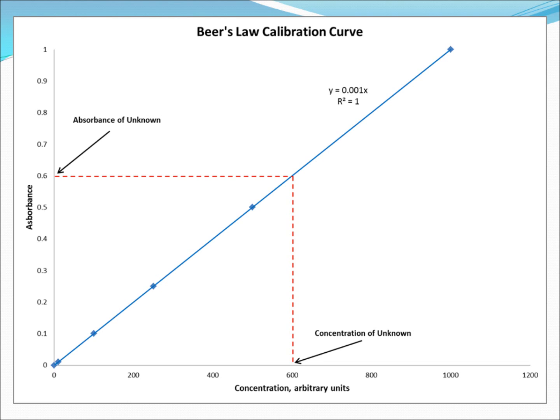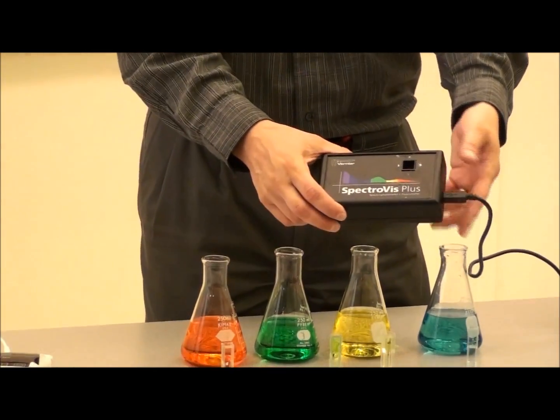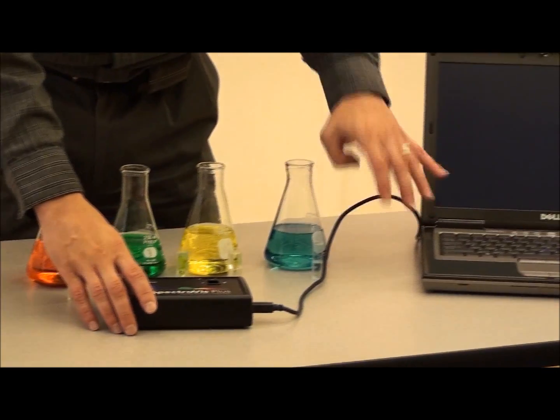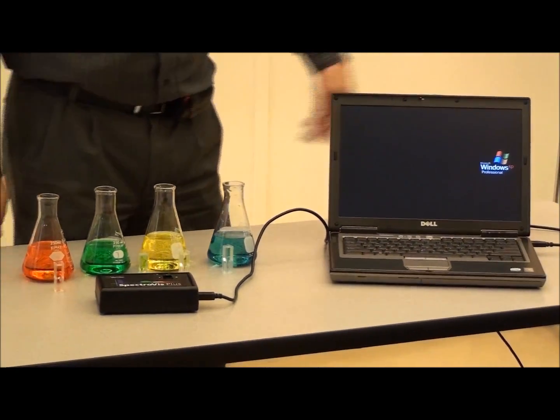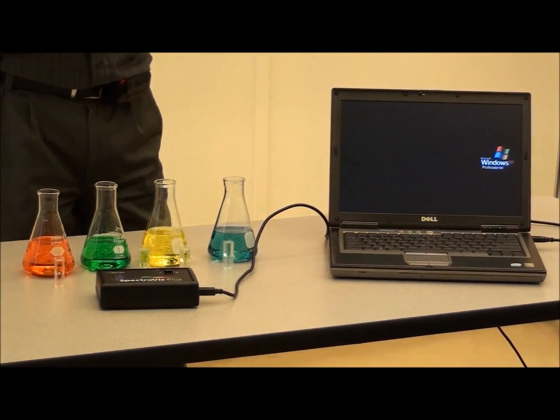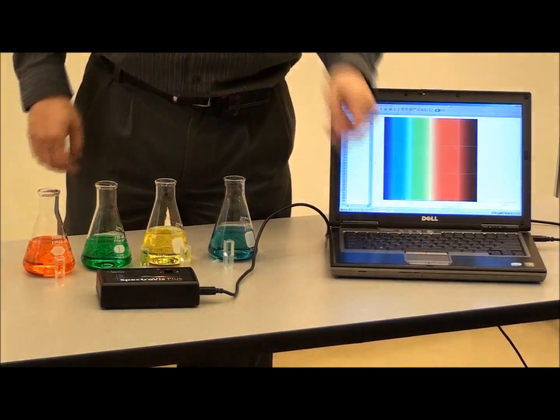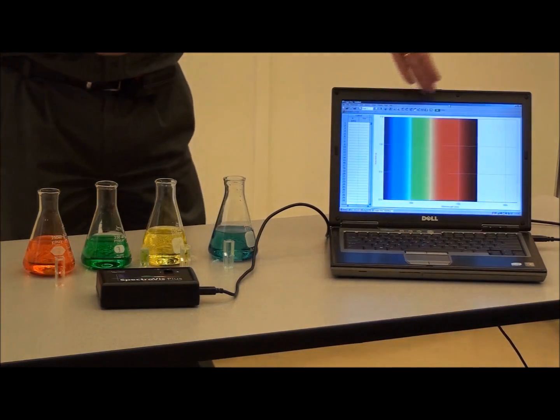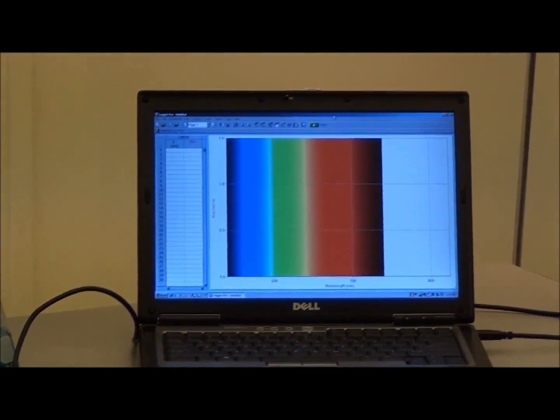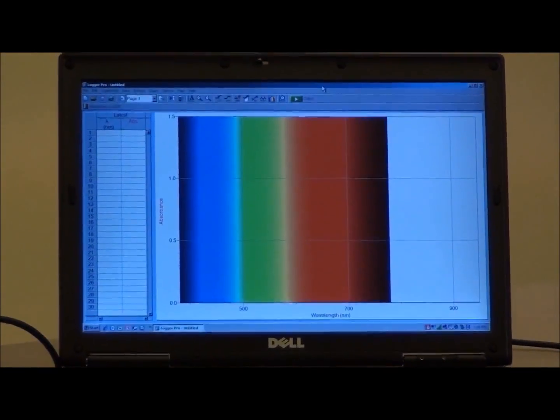It is easy to see that the application of Beer's Law to practical problems is not very involved. Here we have an instrument known as a spectrophotometer, which can easily measure the absorbance of a solution that is contained in a square holder called a cuvette. This particular spectrophotometer is connected to a laptop computer via a USB cable. The computer displays the absorption as a function of wavelength. We have absorbance on the y-axis and the wavelength on the x-axis.